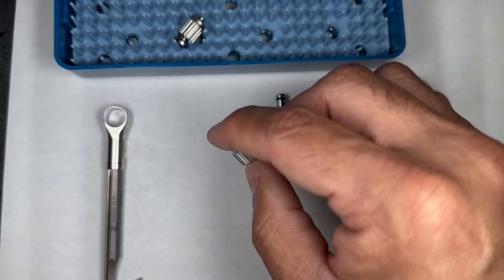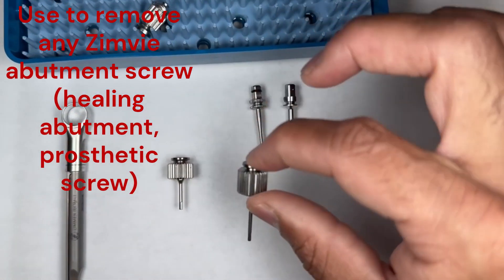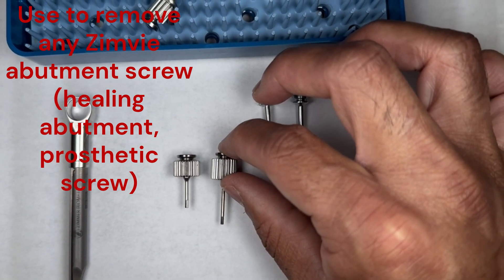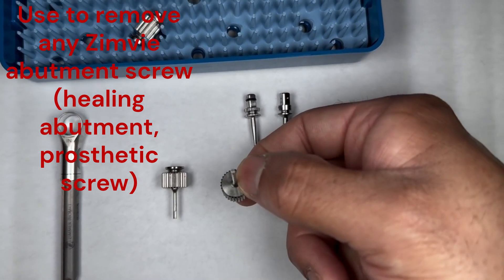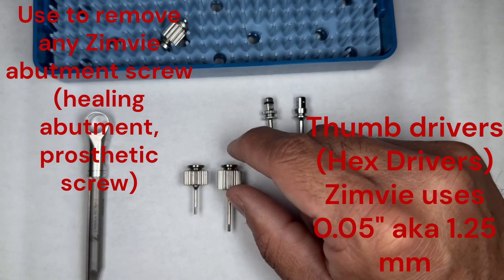We've got a couple of other simpler pieces: there's going to be a short one and a long one, and those are just good old-fashioned thumb drivers or hex drivers. These will go into healing caps or prosthetic screws.